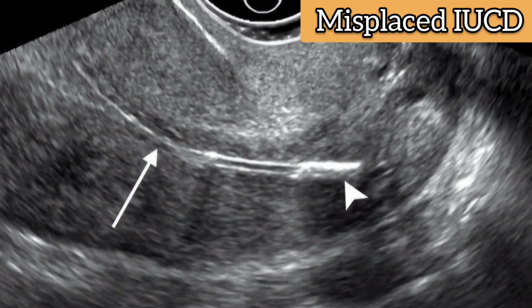This is an ultrasound of a young lady who presented to us with pelvic pain and excessive bleeding after the placement of an IUCD. Ultrasound is showing migration of the IUCD within the lower uterine segment. Today we will discuss what the different types of IUCDs are, what the complications are, and how you will diagnose a misplaced IUCD on ultrasound.